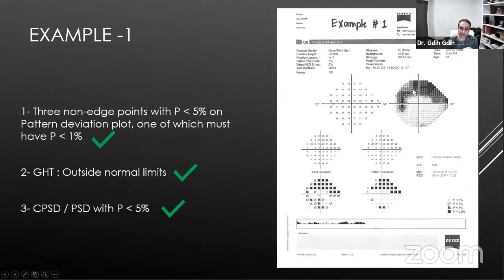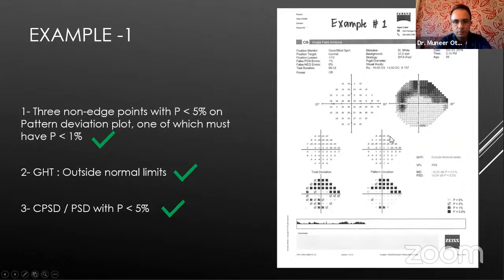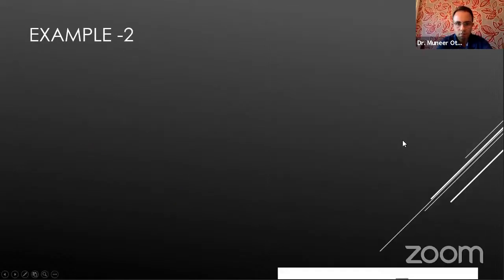You may if the upper eyelid is too droopy, but you will notice that clinically, and you would have screened that already. Remember that slide I showed you? Does it make sense? If anything is missing from these steps, you're not going to go further. You're not going to call this or give it any significance before you address the other things. Thank you. You're welcome. Okay, example number 2.